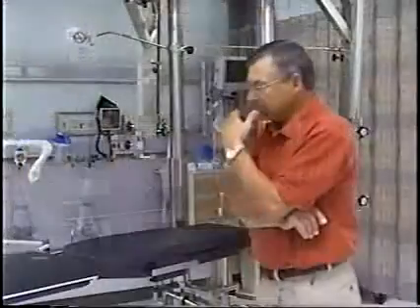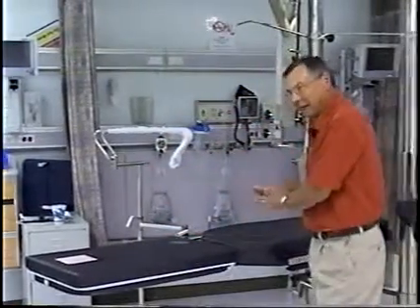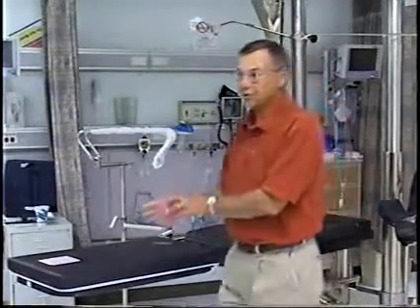What I'd like to do, with your permission, is to break the table down, and have a couple of people set it up, and I would recommend that the table be left set up for a left hip. Believe it or not, most fractures occur on the left side.